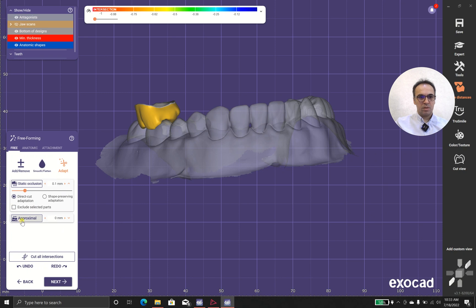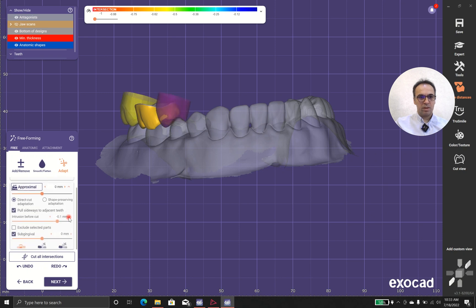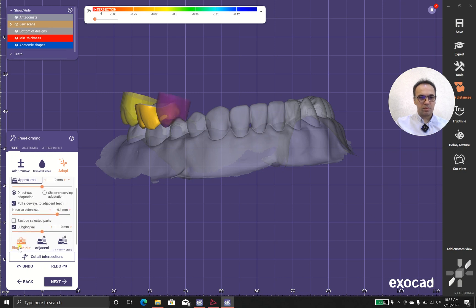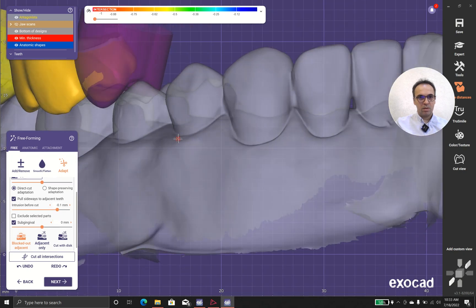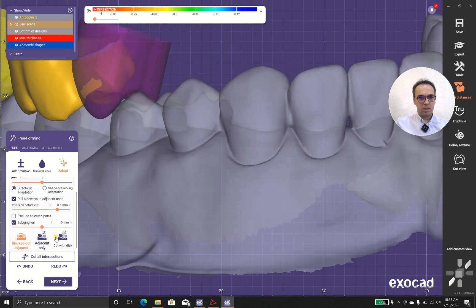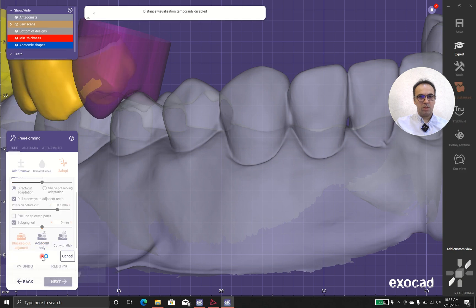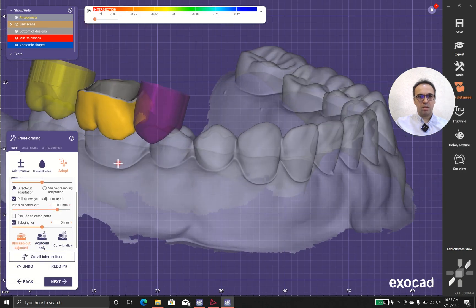I do this proximal again and the pull sideways. And okay.